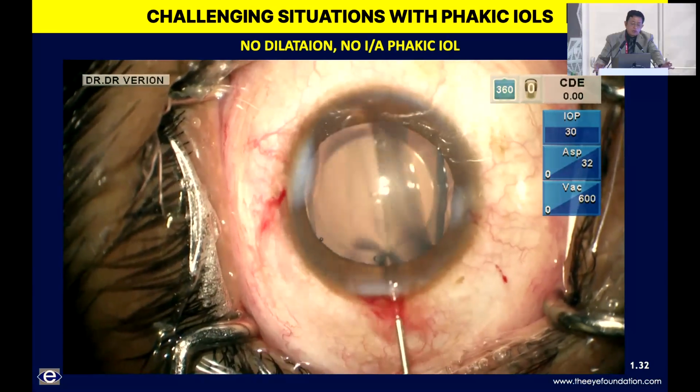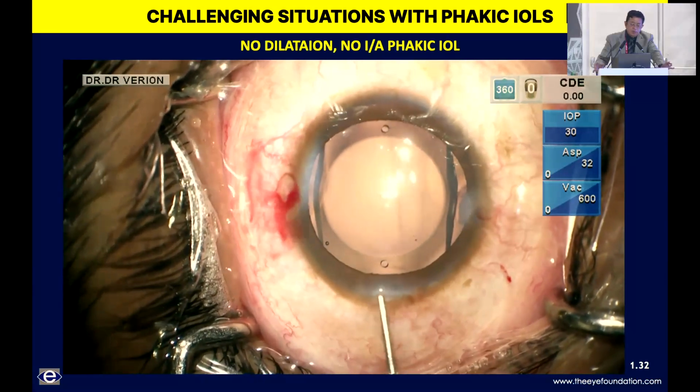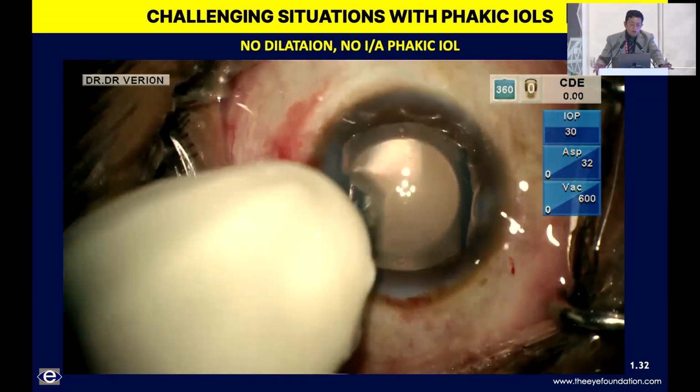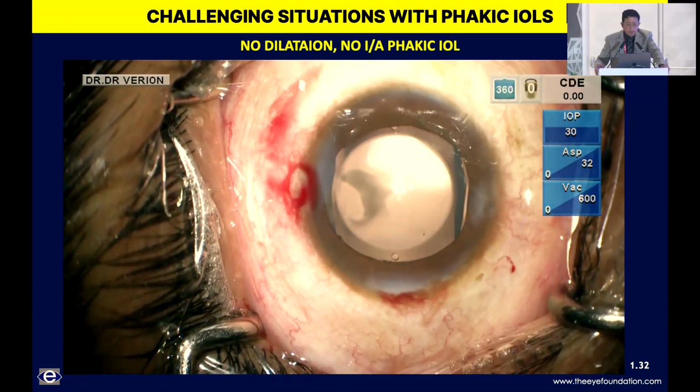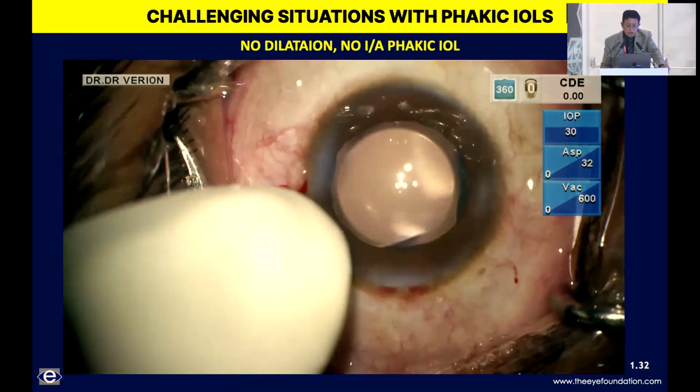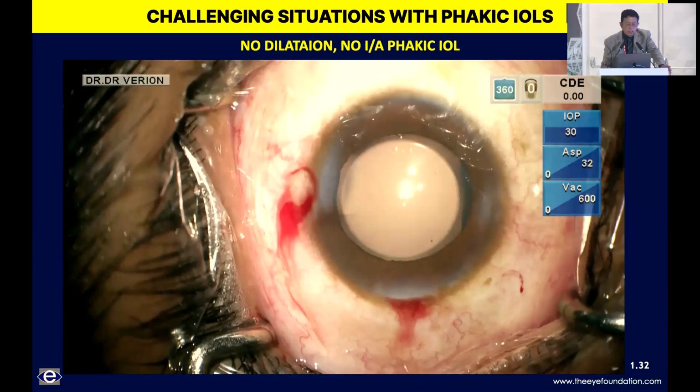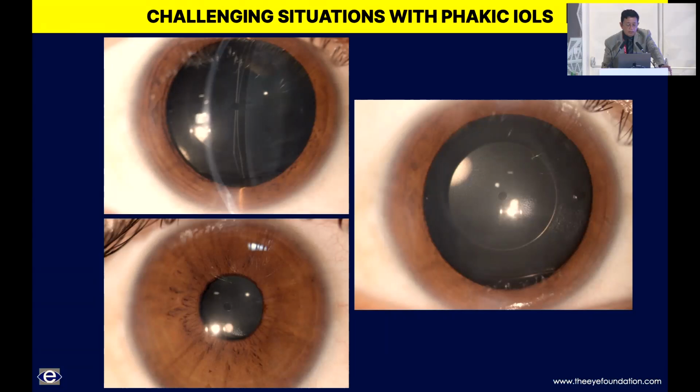And all you do is go ahead and inflate the main port and the side ports, and in case it's a toric intraocular lens, align the lens properly, and it works well. I suggest you consider these 2 tips: not to dilate the pupils beforehand, and secondly to use cohesive viscoelastic, which was not originally taught. And usually you end up with optimal results, like was shown by the earlier speakers also.